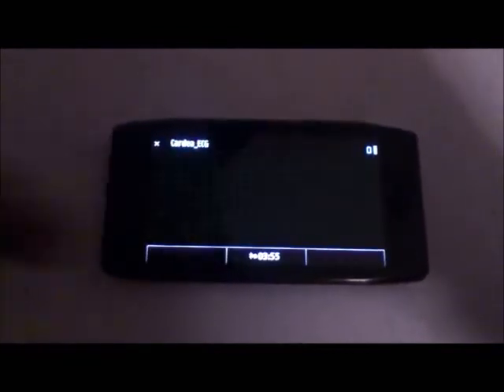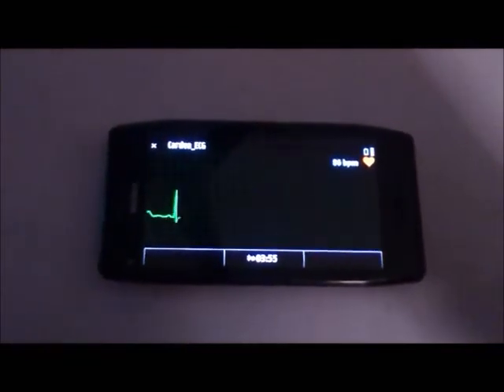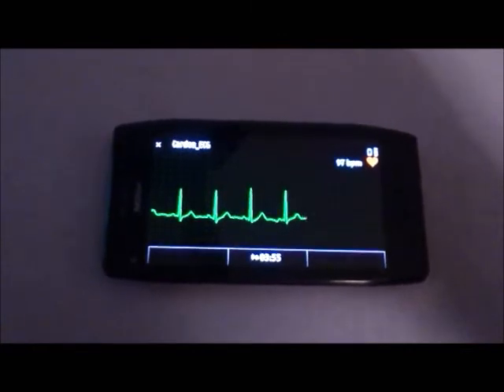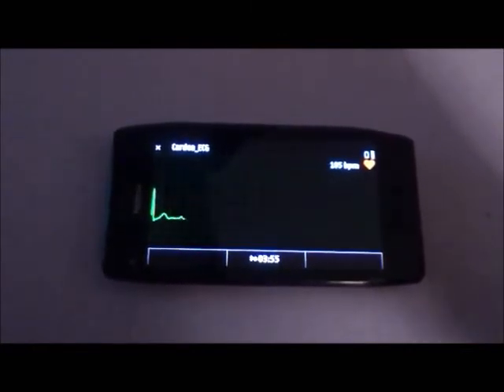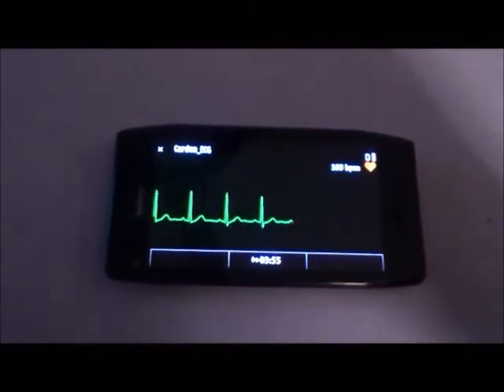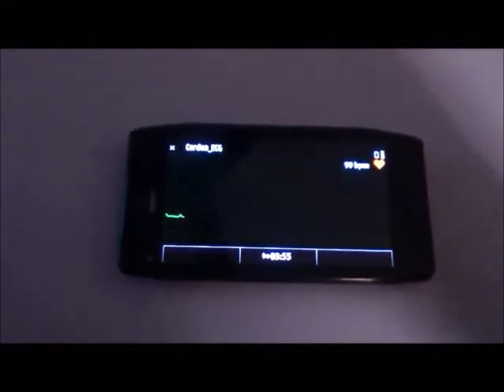I allow the app to modify data in my phone to allow data saving. As you can see, it is plotting a real-time, very clean diagnostic quality ECG.